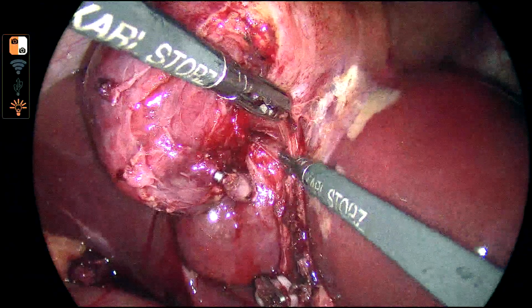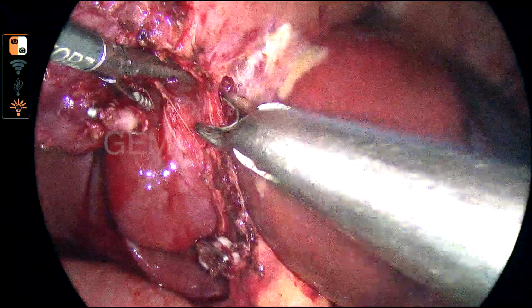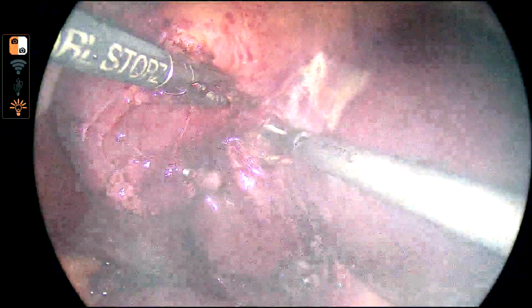Even the gallbladder mesentery is edematous. Now you can see I have circumferentially mobilized, and now I am clipping the posterior branch of the cystic artery. Now you can see it is going to the gallbladder only.